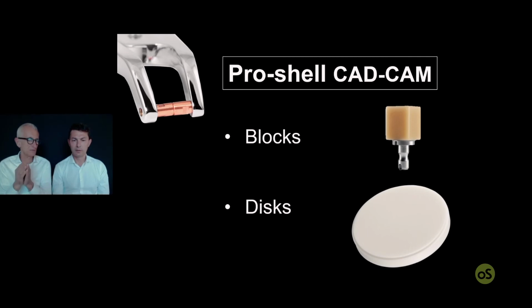Obviously, we are talking of the 3D printer that we have, because there are a number of these machines, and some machines probably are slower and some are probably faster. Yes. And, right? So yes, this depends always on the budget. And the post-curing time of the material, for sure.